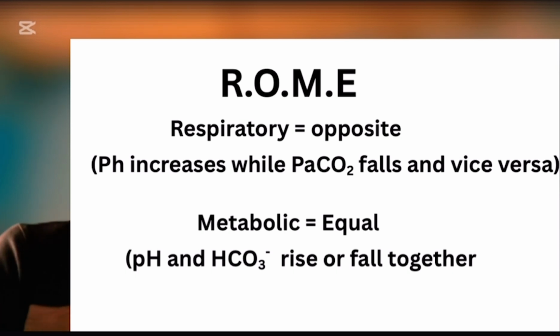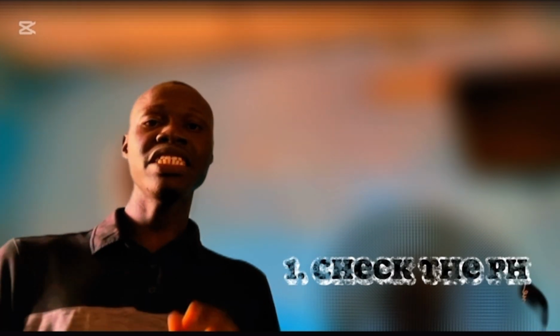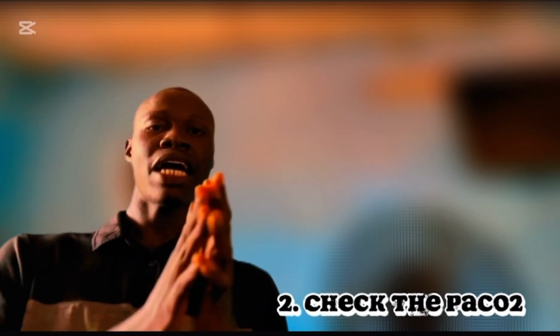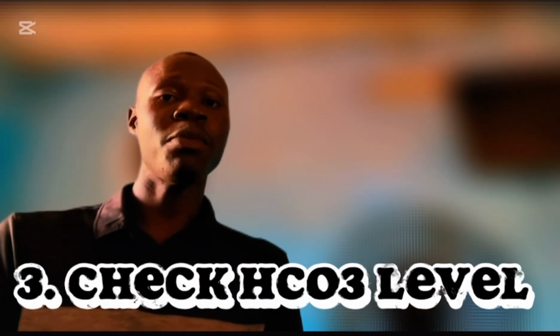Now we are going to look into the 6-step ABG interpretation. So work with me as we do that. The first thing you are going to do when you see any ABG result is to check the pH. Is the pH high? Is it low? Or is it within the normal limits? Then the second thing you want to do is to check the partial pressure of carbon dioxide, which tells us about the lung function. And after that, you look at the bicarbonate levels, because the bicarbonate level tells us about the metabolism.